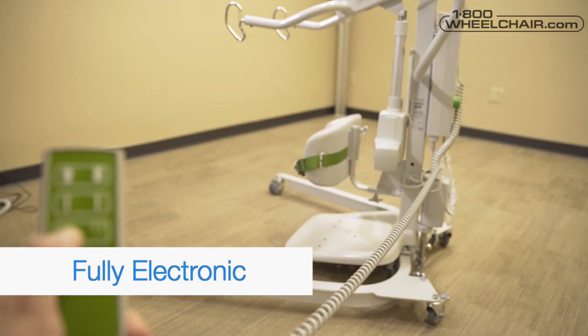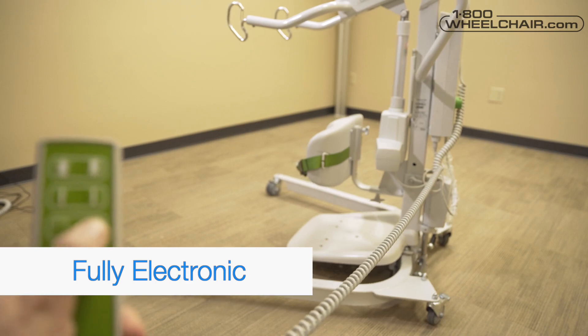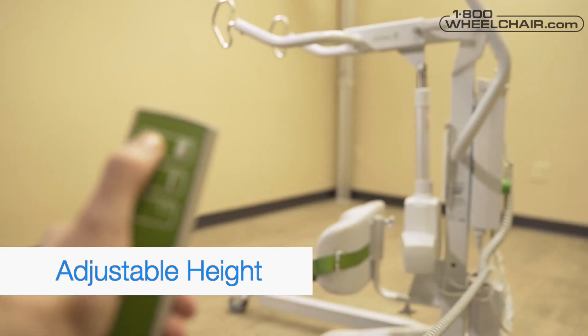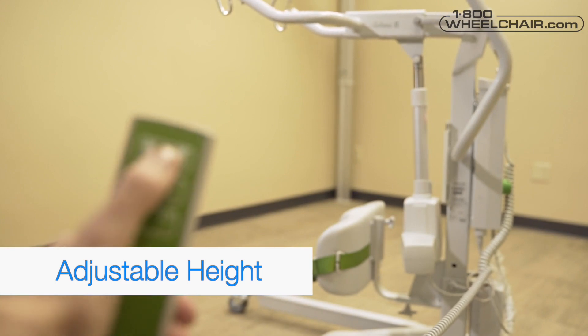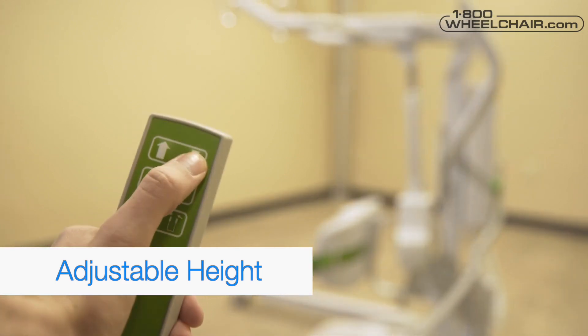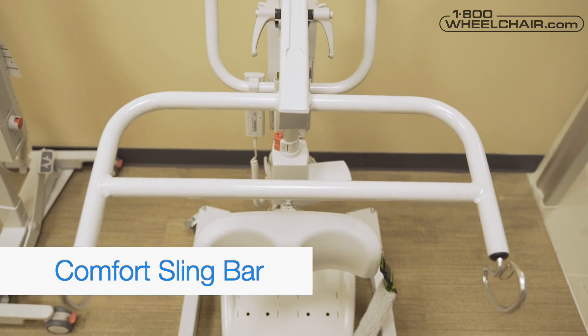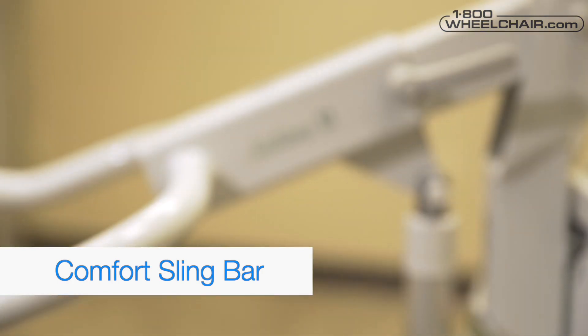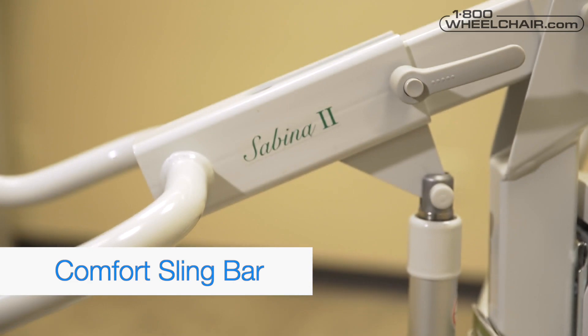Fully electronic: the base on the Sabina 2 is adjusted electronically to accommodate toilet and seating. Adjustable height: there are different settings for patients with different heights. For patients who are sensitive to underarm pressure, they may use the comfort sling bar and comfort vests in combination with the Sabina 2 lift.